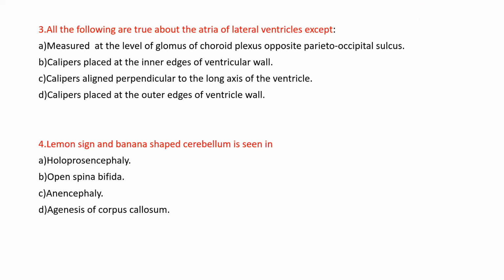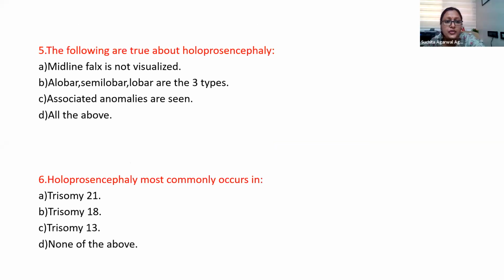Next question. Everybody should know why there is open spina bifida and why there is a banana sign, which Dr. Suchita and Professor Purana have explained. I think we will talk about it afterwards. We'll analyze and discuss that. Dr. Hasmukhlal will discuss all the questions.